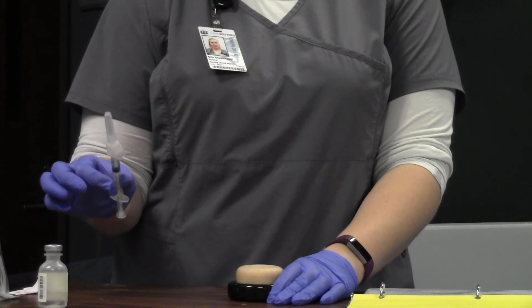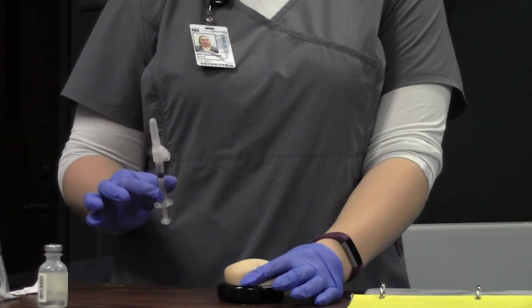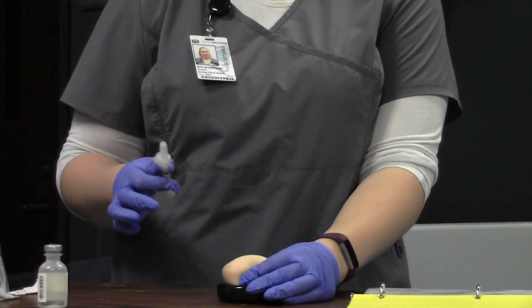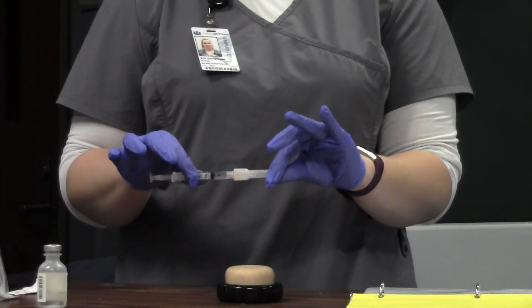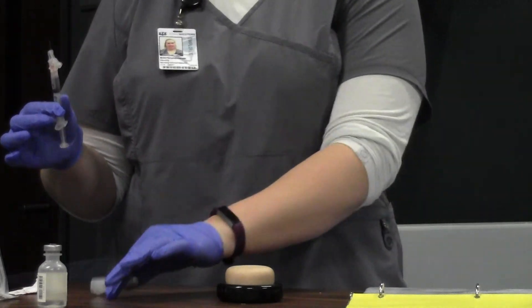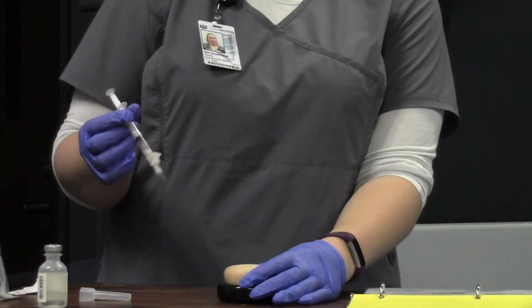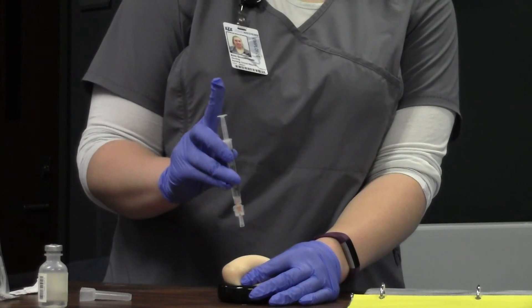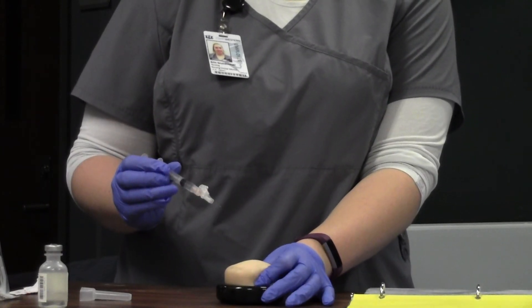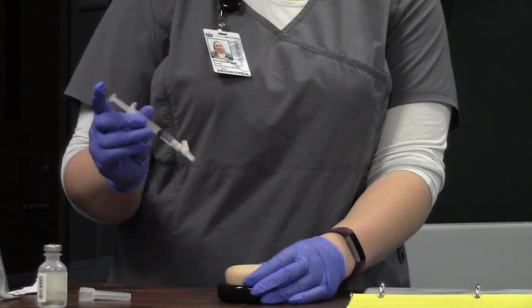I'm going to then make sure that I get a good pinch. If it is a smaller person, get as much fat tissue as possible. If it is a regular-sized person, go ahead and do a two-inch pinch, just like you would for your insulin. I'm going to go ahead and go in at a 90-degree angle, since I have a good pinch. If it's a smaller person, I can go in at a 45-degree angle, just depending on how much fat tissue I can get.